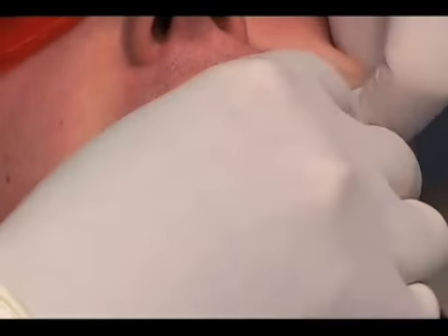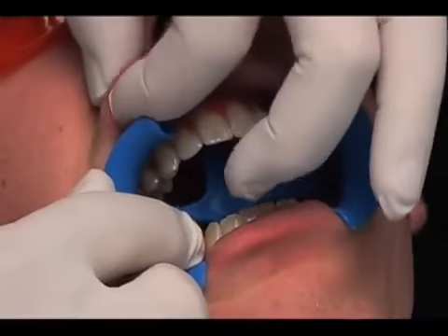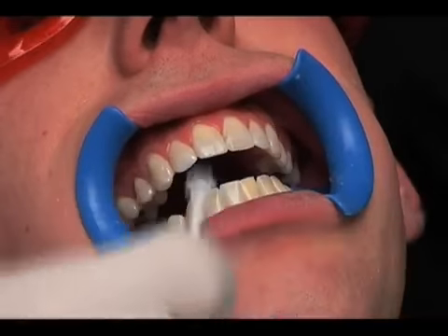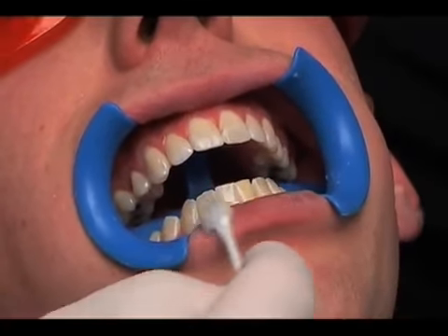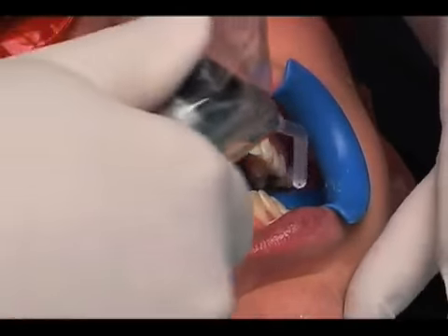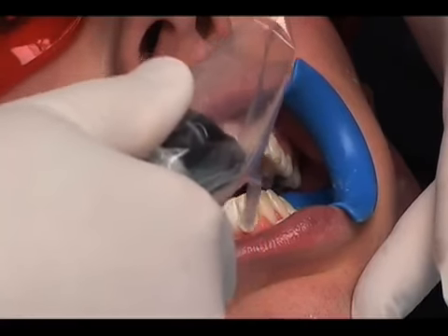Place cheek retractors and cover exposed lip surface with petroleum gel. Be certain as much of the lips as possible are retracted by the cheek retractor. Cotton rolls may aid in protecting the lips from coming in contact with the whitening material. Dry the teeth and gingiva using your air water syringe.